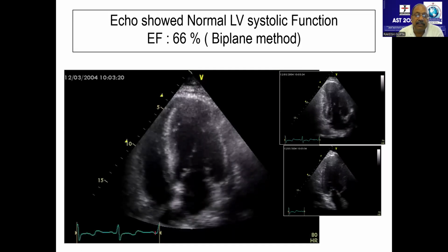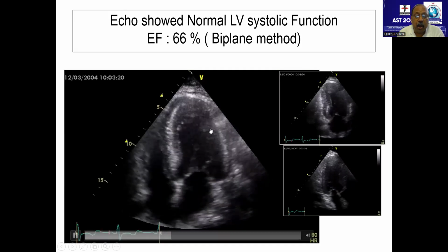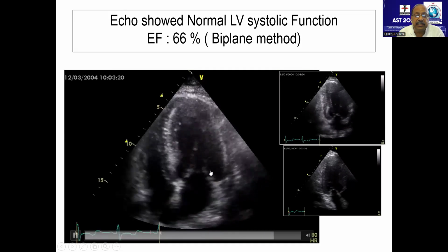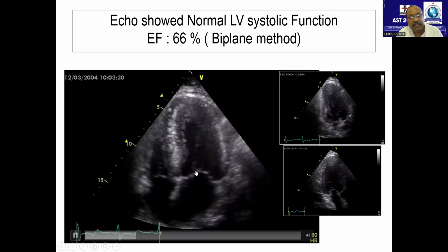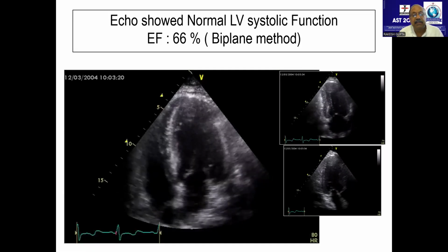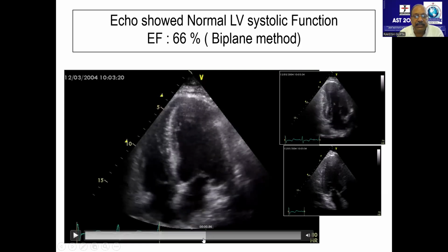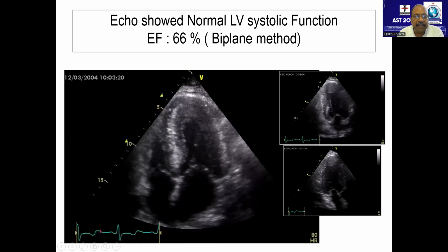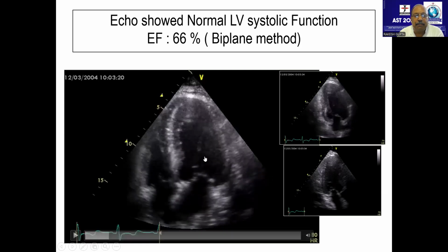One important thing, one person asked about a fuzzy or irregular margin which we cannot see with systole. No, it's not possible. In fact, when we have a systole, we can see very good margins. When we have a diastole, we can have poor margins, as you can see in this picture. Look, in systole I can really see the margins of the endocardium over here. If I go to diastole, my margins really become blurred.